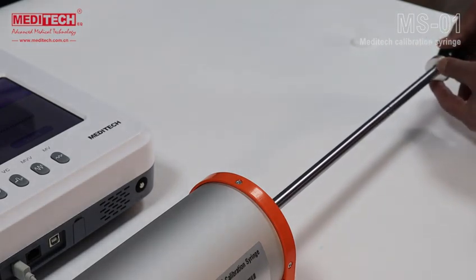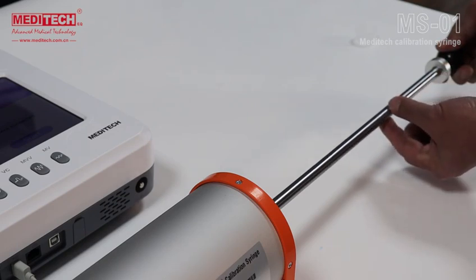If you are performing a 3-liter calibration test, this ring must be in this position. If you are carrying out a 2-liter calibration test, you can place this ring in this position.